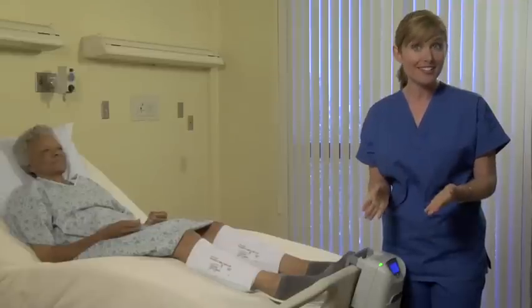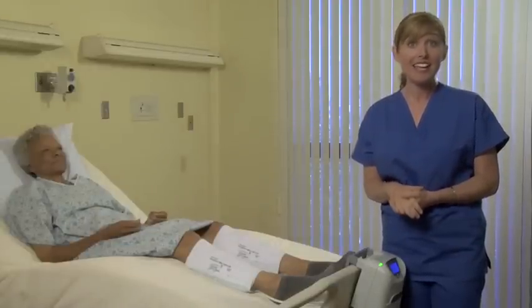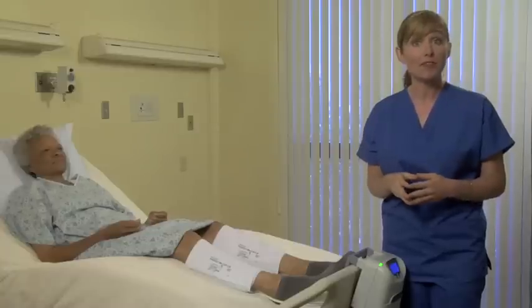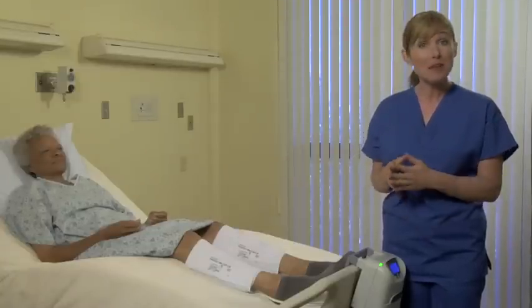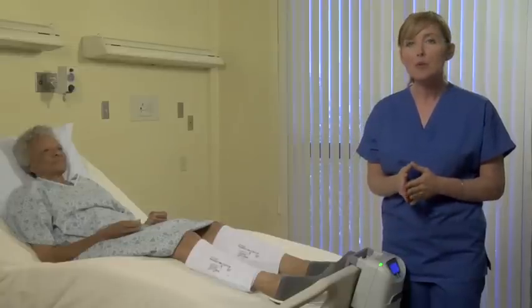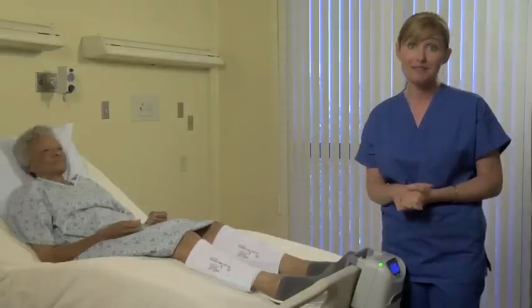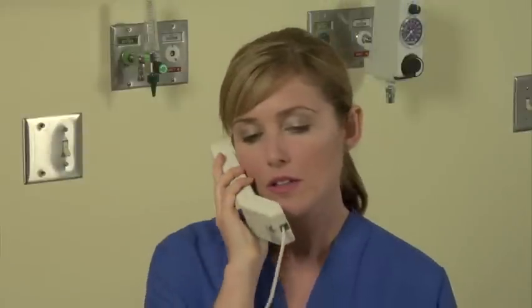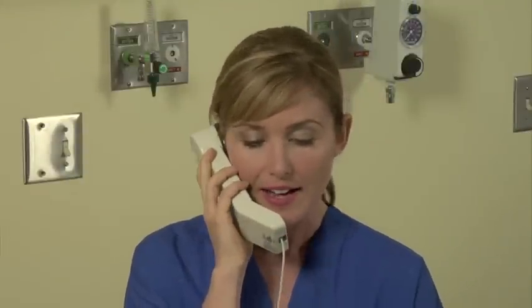If the check tubes alarm persists, then call DJO customer service to get a device replacement. If there is a more serious internal malfunction of the device, you may get a call for service alarm. You may press the on/off reset button to reset the alarm; however, this alarm will persist and the device will no longer function until the problem is corrected. In the unlikely event of this situation, you must call customer service to return the system and to get a replacement.